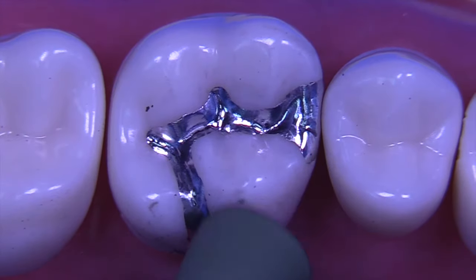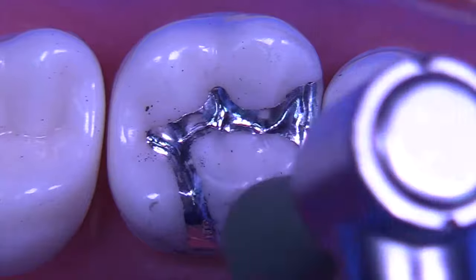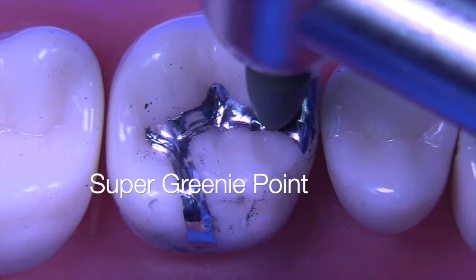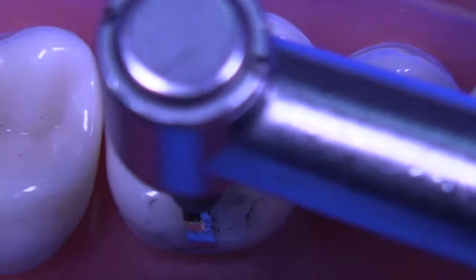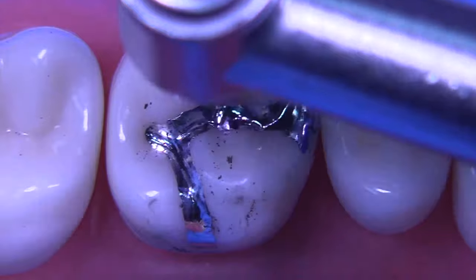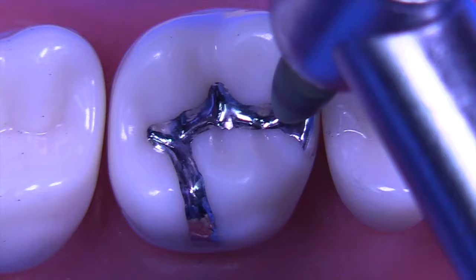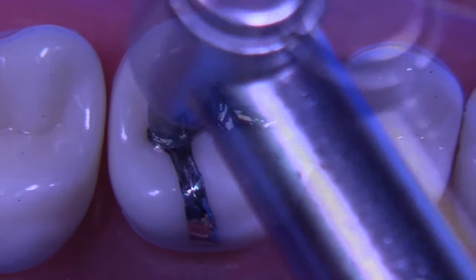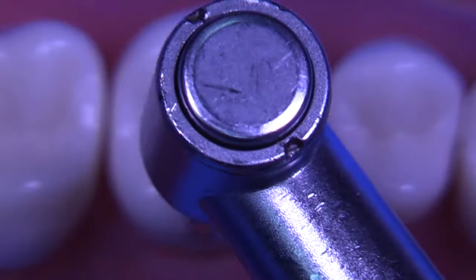We can use cups as well — this is a greeny cup, and then super greeny cups and super greeny points. We're going to finish this amalgam with the super greeny point and plenty of air spray to keep the tooth nice and cool and give us a nice final result. I don't think polishing amalgam is an absolute requirement in restorative dentistry, but it does provide for a more comfortable restoration. It's going to be less likely to trap plaque, and they're nice to look at on recall visits.